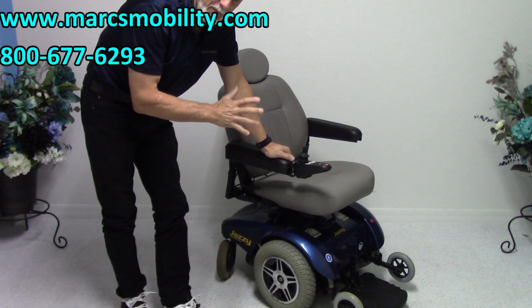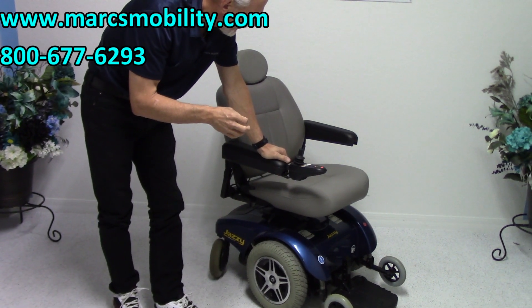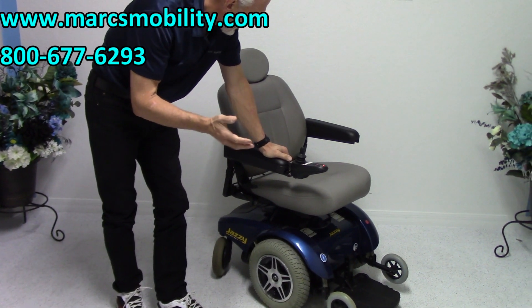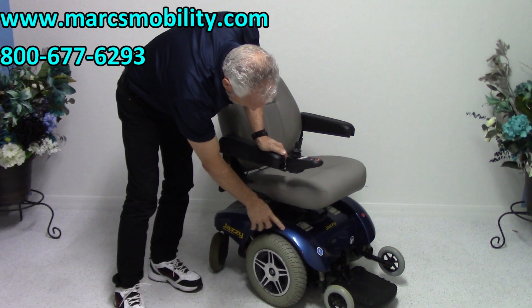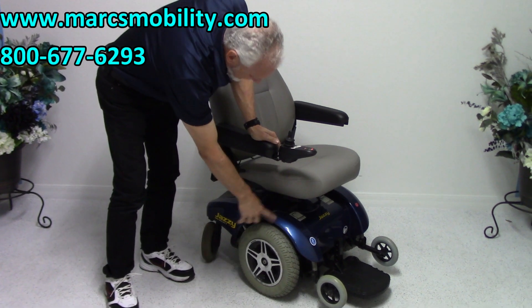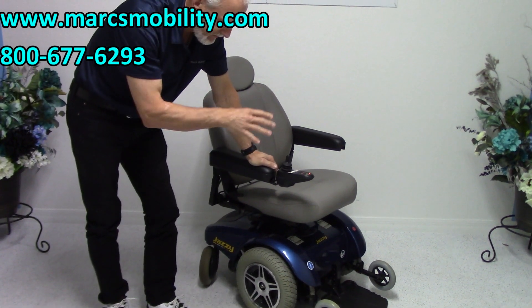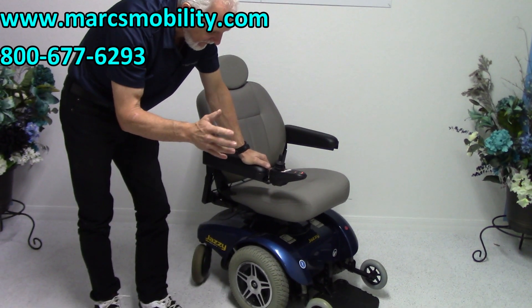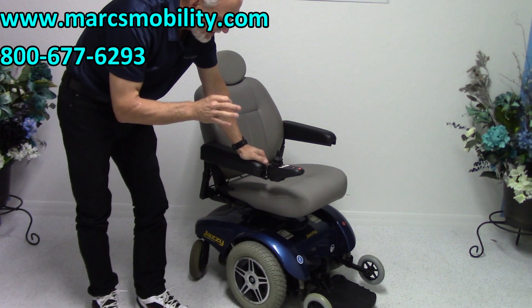This chair was used for about 3 to 5 months. It's an older model but has been sitting in someone's home for a while — you can see it was kept inside. It does have a little scratch, but it's practically new, used only 3 to 5 months and in excellent condition.